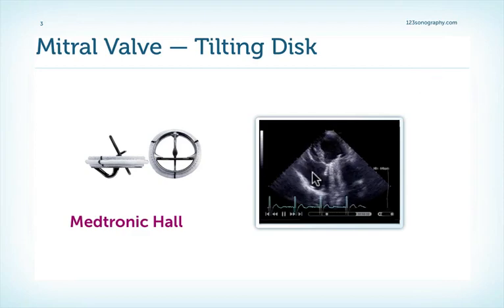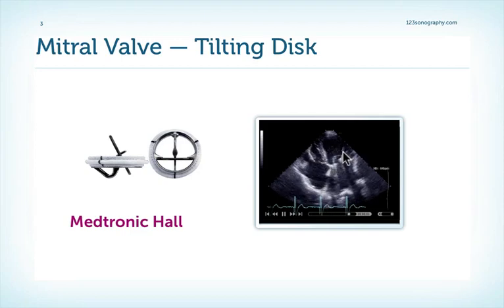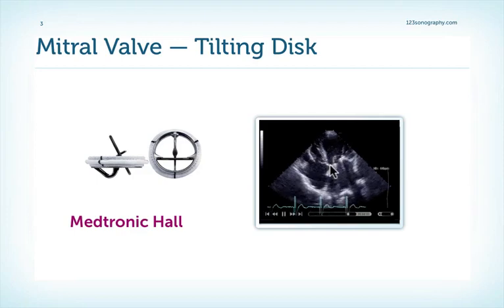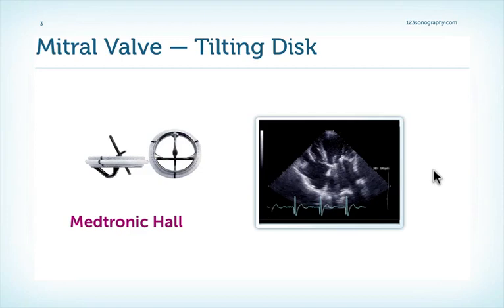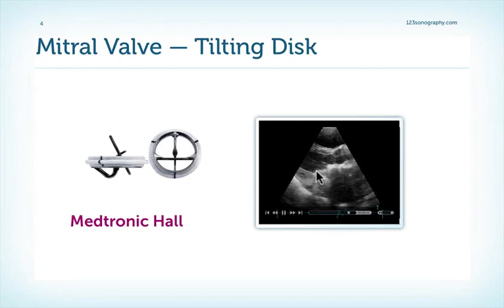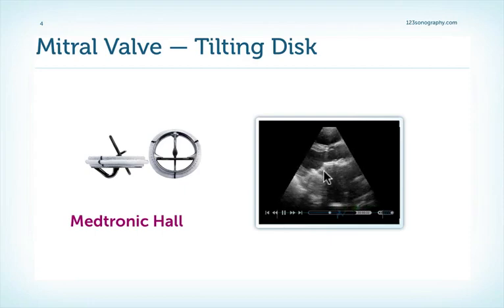We can first of all note that there is a lot of shadowing of the left atrium, which is typical for mechanical valves, and we can only see one disc. This might be difficult to visualize, so you have to rotate the transducer until you really see this one disc open and close nicely. Here's another patient, also with a tilting disc valve, this time a parasternal long axis view. Again, you can see that there is only one disc which opens and closes, and you can see the shadowing of the mechanical prosthesis.